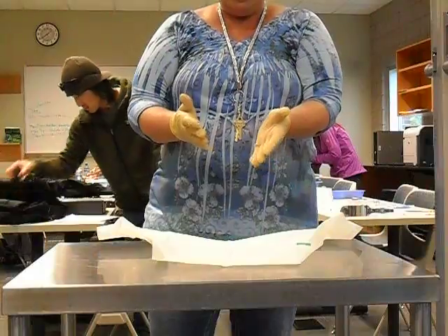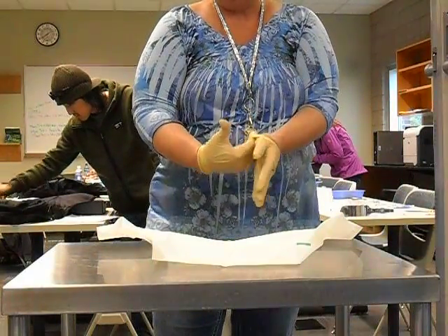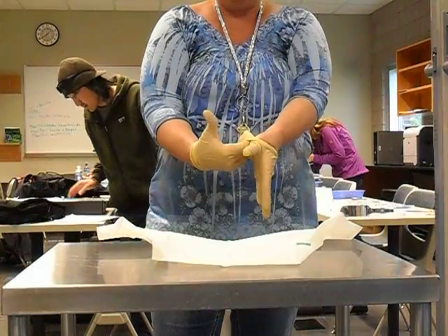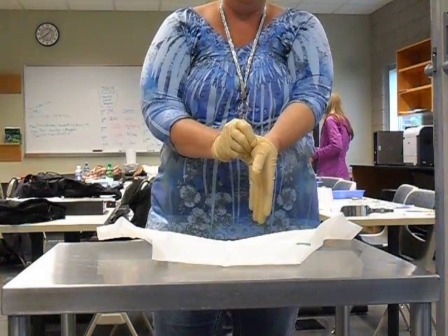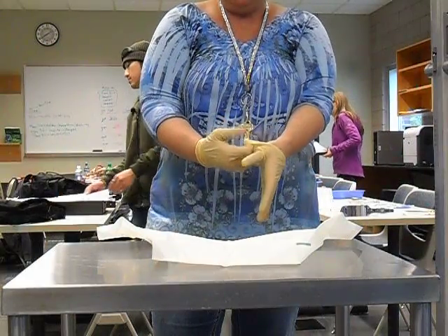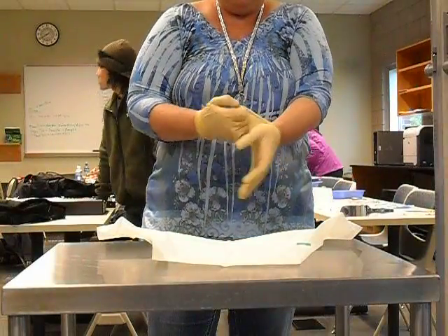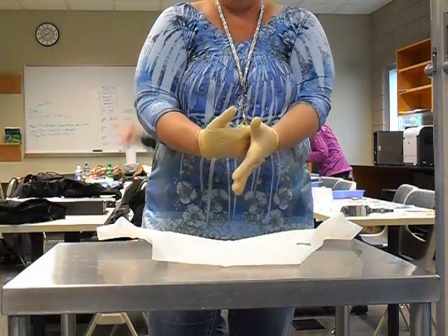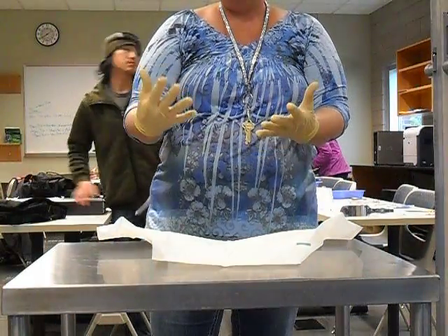So the one thing that I see happen is when the students go to put the glove on, they tend to want to put their thumb here and fold the glove back. That's a no-no. You would contaminate your glove. Another mistake students make is they just snap and then they touch. So get your glove to the wrist and back your hand out. And that's open gloving.